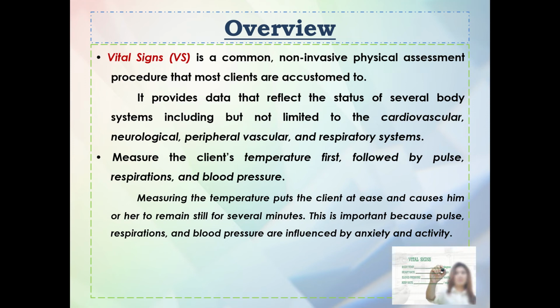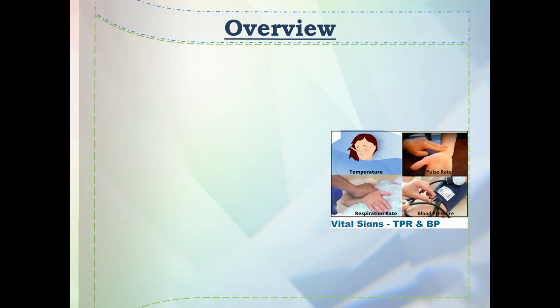So kumbaga, inuuna natin sa temperature para ma-relax, para maging comfortable yung pasyente natin. Because kung siya ay anxious or hindi siya comfortable sa kanyang sa ginagawa natin sa kanya, so magkakaroon ng alteration sa pagkuha natin sa kanyang respiration, blood pressure, and pulse. So mahalaga na si client or si patient is comfortable and relaxed. That's why we take first the temperature.